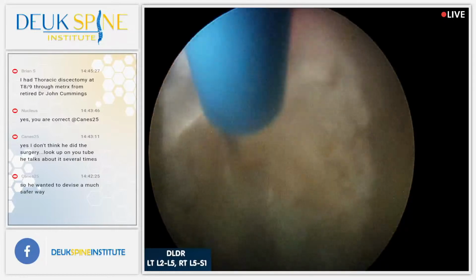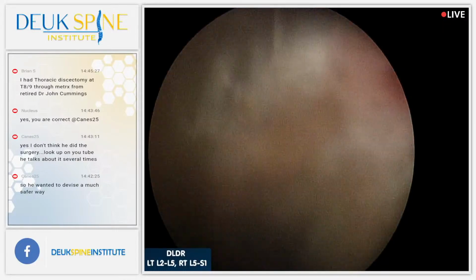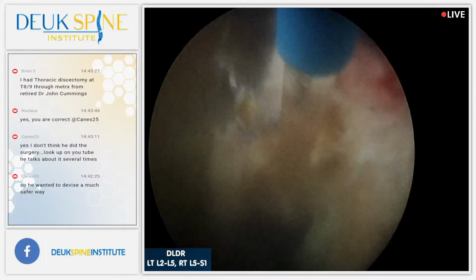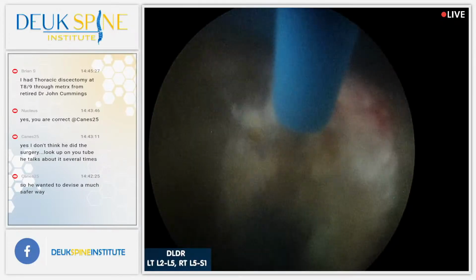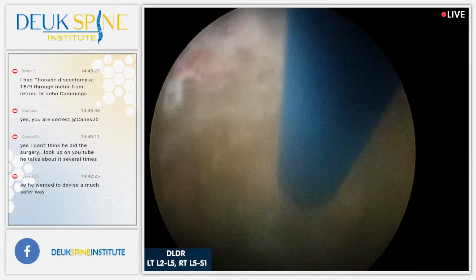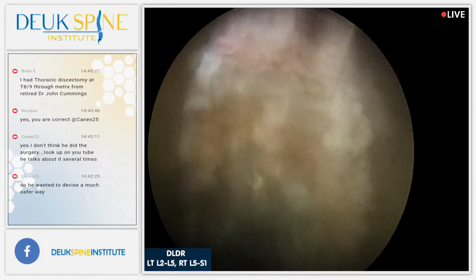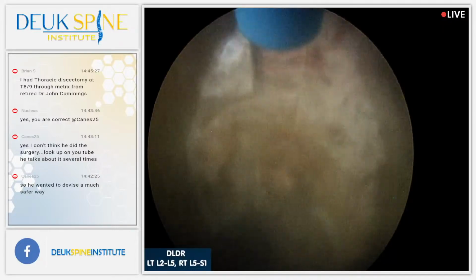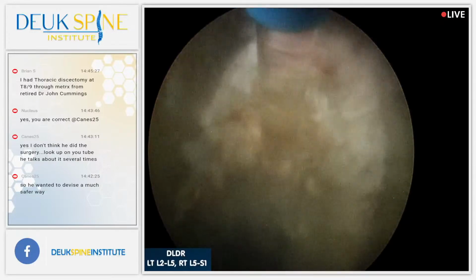Yeah, great question. So if you watch earlier, as I was trying to get into L5-S1, I finally found a way. I had to go around the abnormal bone. And there was just like a little hole still left, you know? You know when you watch those movies like Star Wars, where they're flying the Millennium Falcon and the hole is closing like the giant worm coming out of the planet, and his mouth is closing as they're flying out of his stomach, and it goes between the teeth and it snaps closed. Anyway, that's like that tiny bit of room left. That's what I had to navigate through, just like the Millennium Falcon did.